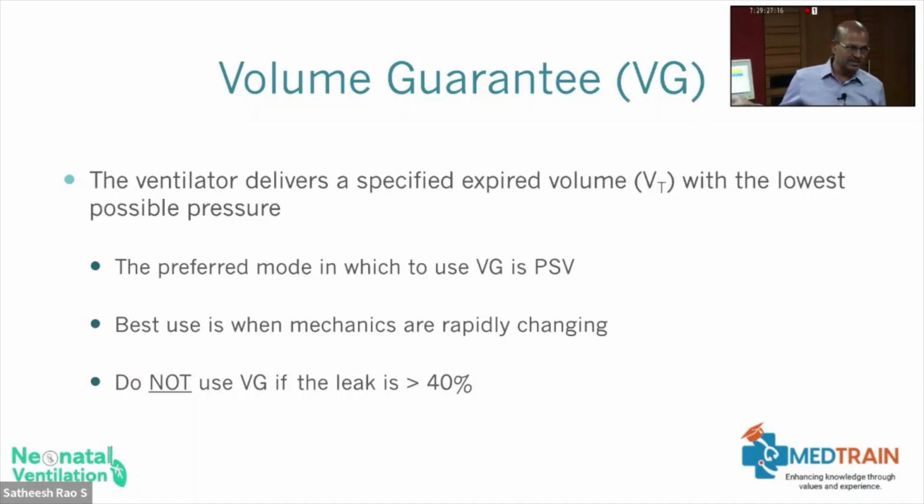Similarly, don't change the tube just because you have a leak. If the baby is coping well, you can adjust the settings according to what the baby needs and manage with it. I mean, what goes into the lung is what is going to damage. What is going to leak out isn't going to damage the baby. Of course, monitor the tidal volume, monitor the baby's blood gas, and then take a call.